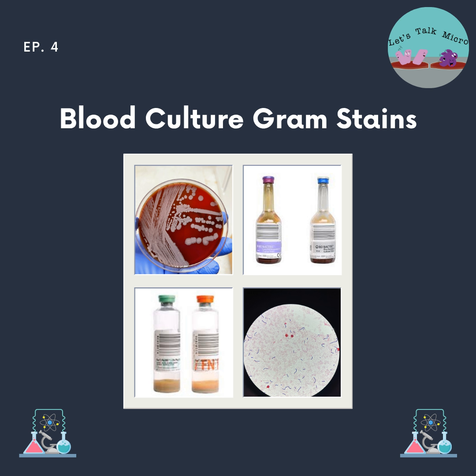And then you're looking for your organisms, right? Reporting your gram stain, either positive, negative. You can say variable. The morphology: cocci, rods, coccobacilli, and the arrangement: clusters, chains. Don't forget about yeast. We can also report budding yeast, pseudohyphae. If we see hyphae, we also report that. So we're looking for these elements and we report them and we quantitate them: 1 plus, 2 plus, 3 plus. And that was covered in the last episode.